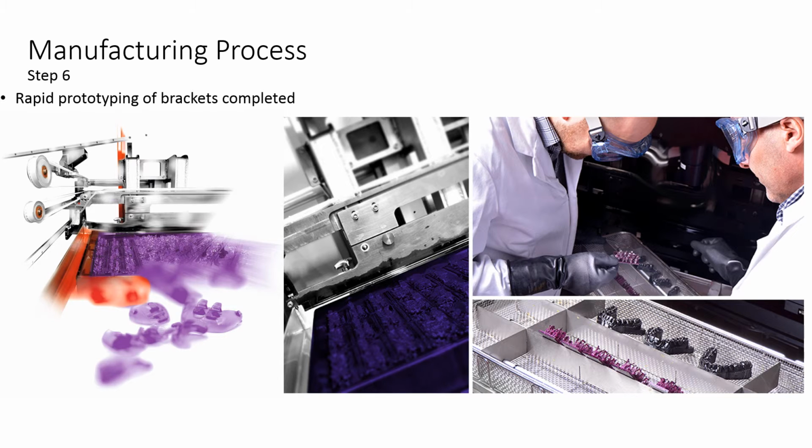So when the whole bracket base and bracket body are designed, the brackets will be printed, because we have printers nowadays. Before that, they used to have 40 wax printers in the company, and basically one printer which prints composite replaced 40 wax printers. So they became far quicker than they used to be, and soon we will probably be able to print brackets directly, but at the moment the problem is still the accuracy and precision of the slot.